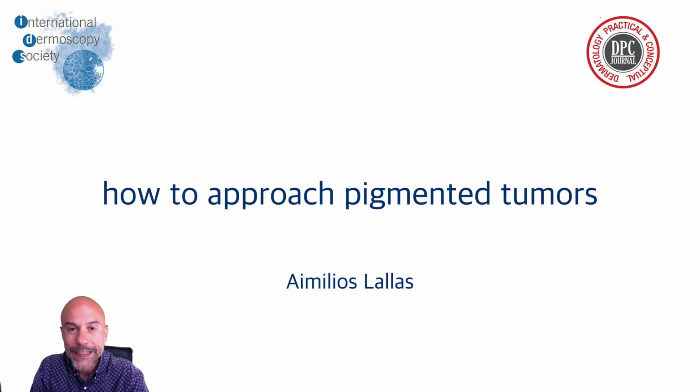Hello, in this video I will present you a proposed approach to analyze pigmented tumors with dermoscopy. So it will be a somehow introductory presentation on the application of dermoscopy, the main application of dermoscopy, which is for the assessment of pigmented tumors.